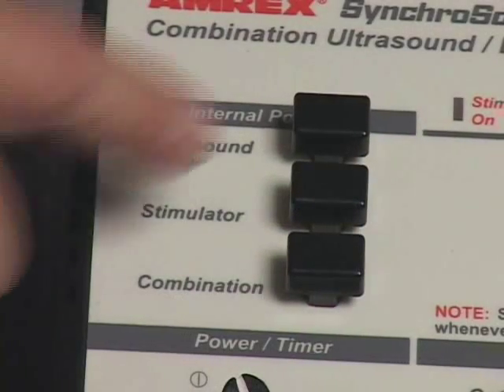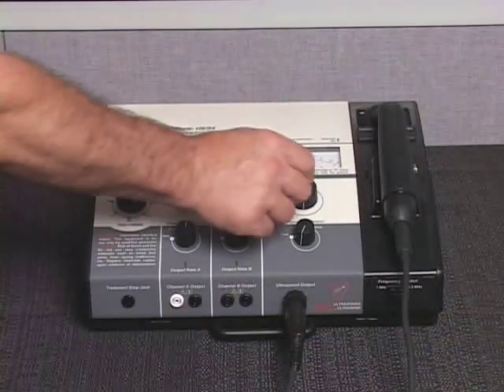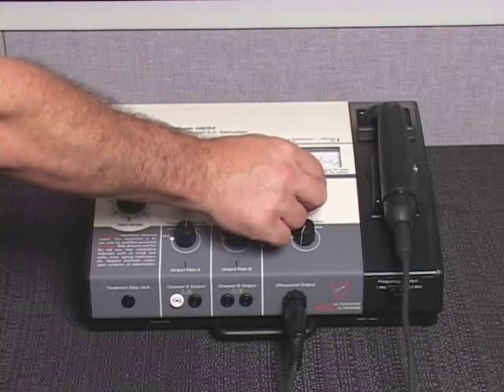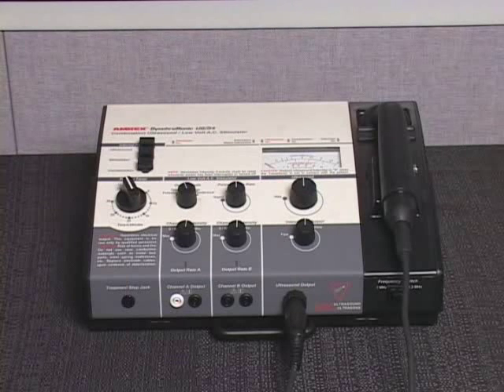Depress the US54 internal power ultrasound switch to the on-down position. Reduce the ultrasound intensity control to zero and set the ultrasound interrupted output control to the off position, enabling the audible click.